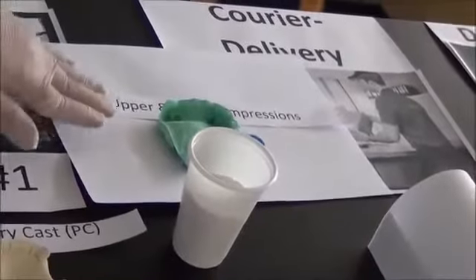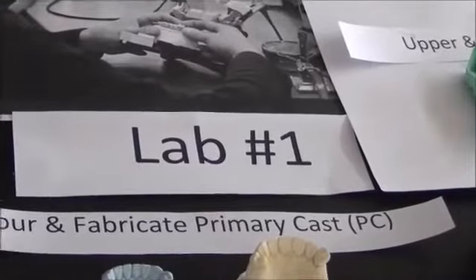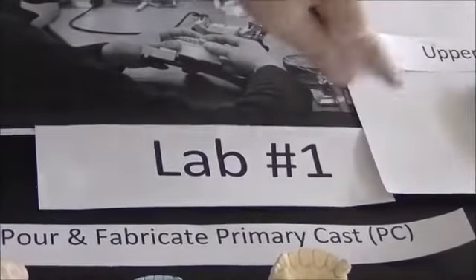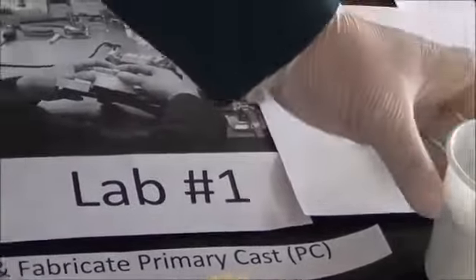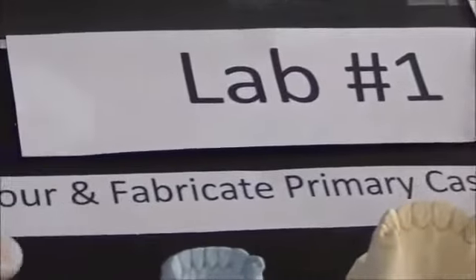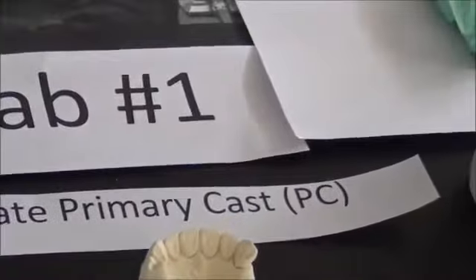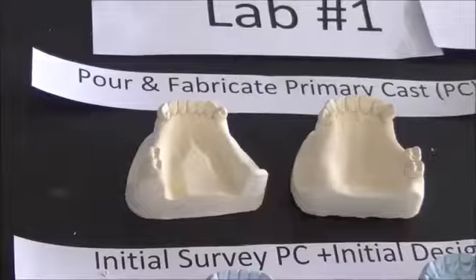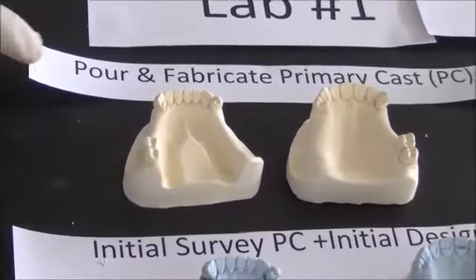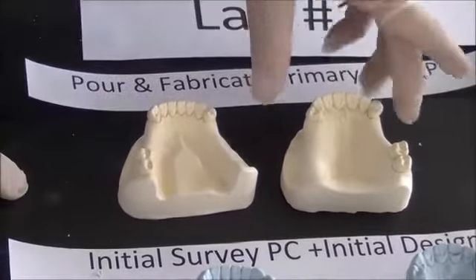So in the dental lab, the dental technician will receive this, disinfect it, if it was not disinfected in the clinic, then begin the pouring process. And I remind you that primary casts are poured using plaster. The pouring process will result in 2 casts, upper and lower primary casts. These primary casts will also be called study cast, because on them we study our design.